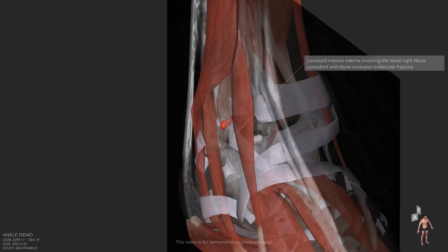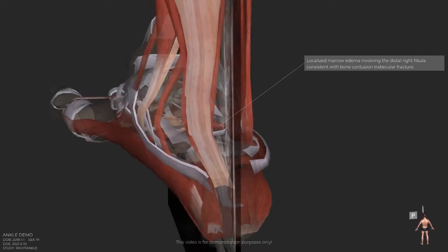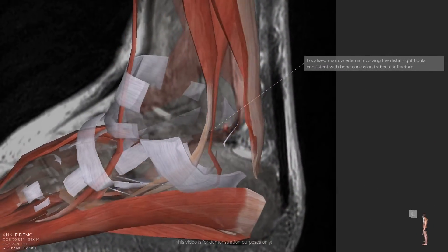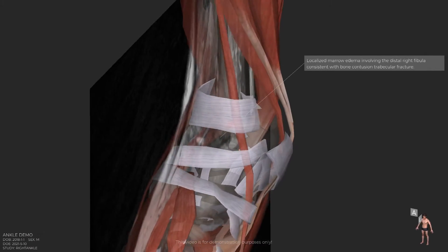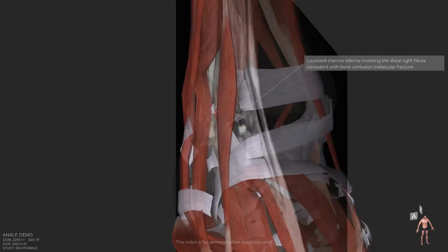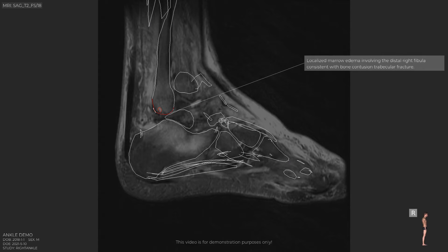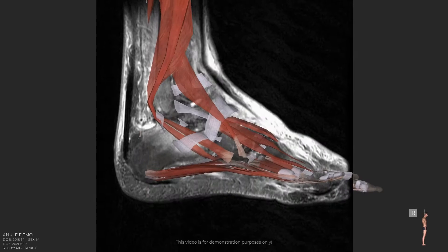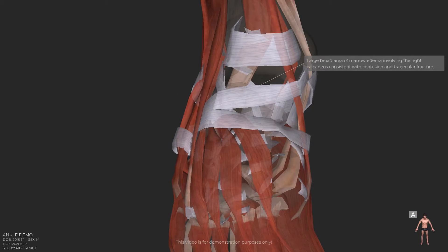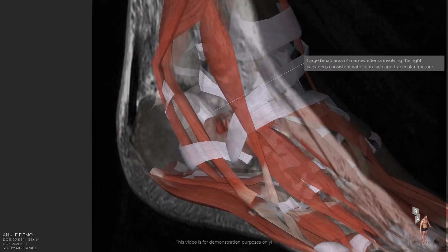Localized marrow edema involving the distal right fibula, consistent with bone contusion and trabecular fracture. Large broad area of marrow edema involving the right calcaneus, consistent with contusion and trabecular fracture.